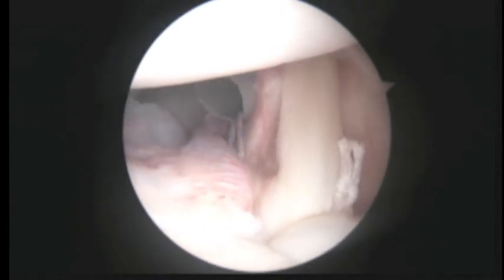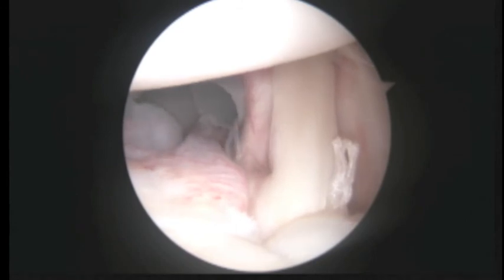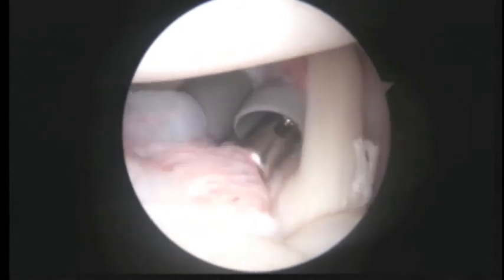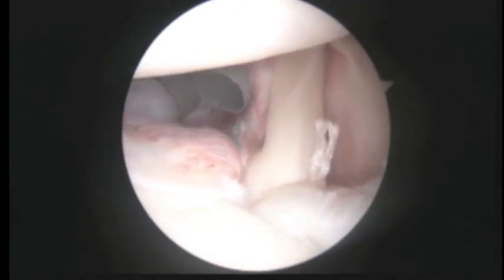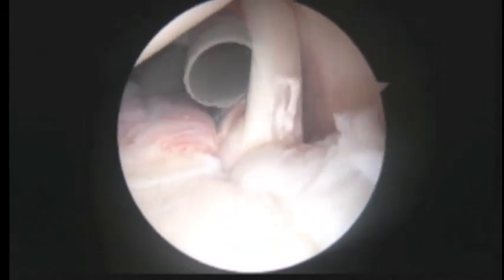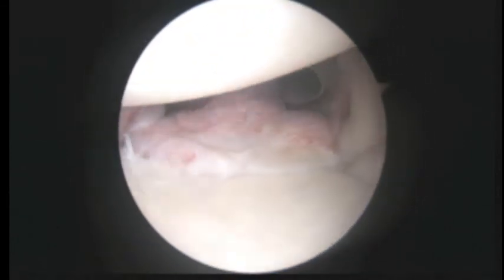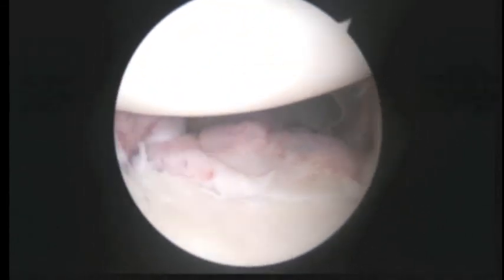Okay, so we'll cut those suture tails next. Just like that. And now that looks very stable. You can see as we tug on it, the biceps tendon, that anchor now looks very stable. So I'm happy with the way that looks. We're going to clean some more things up, but for the most part, I think we're done.